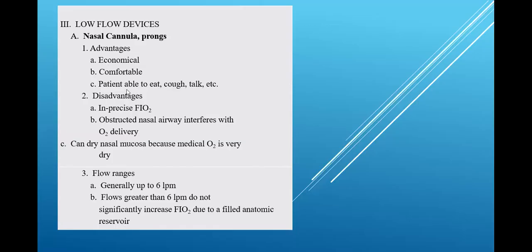All right, but the patient can eat, he can talk, he can laugh, etc., while he's still getting his oxygen, okay? Now, like we said, the disadvantages of that would be imprecise FiO2. That means we can't guarantee what his FiO2 will be. I can't document really what he's on. I can't do it for sure. I can only guess. Okay.